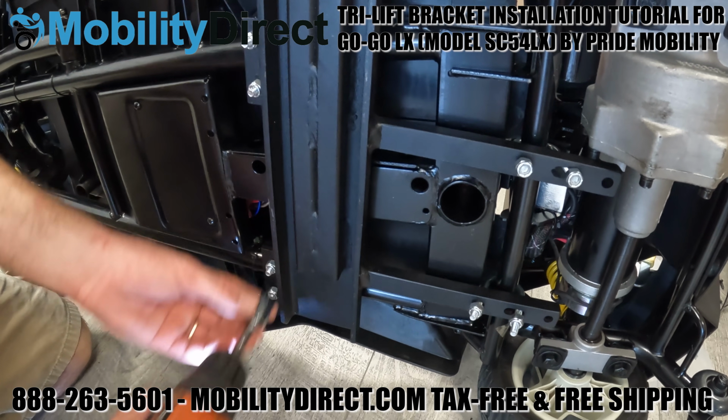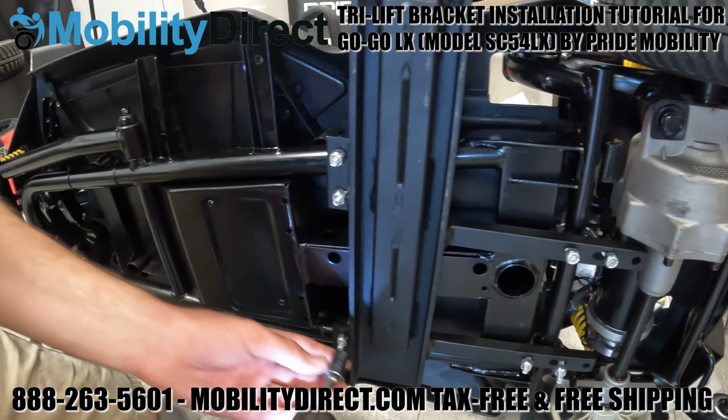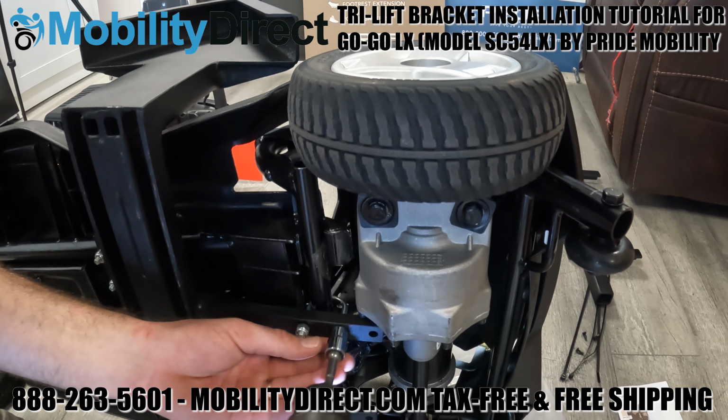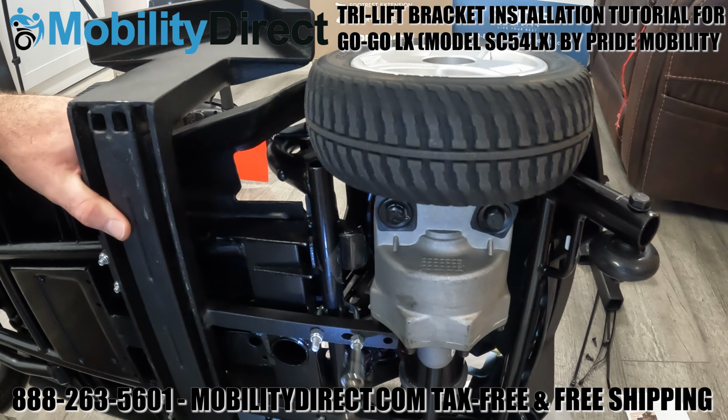So it's really not the biggest deal, but it is worthy to know that once you install this bracket, you can no longer disassemble the front half from the rear half as far as the base goes on the mobility scooter itself. So what we're doing now is we're just tightening everything.